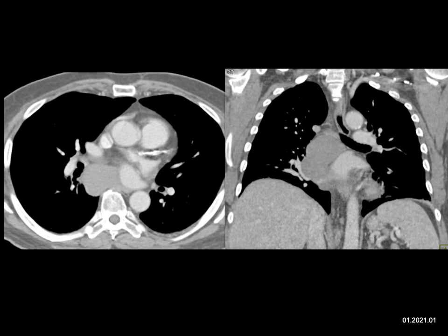Well, now you look carefully at the differential here. Lymphoma, but again, solid, usually more than just that area. Metastatic renal, they're usually vascular, not cystic looking. This is not the pericardium, so it's not a pericardial cyst. So the best answer indeed is a bronchogenic cyst.